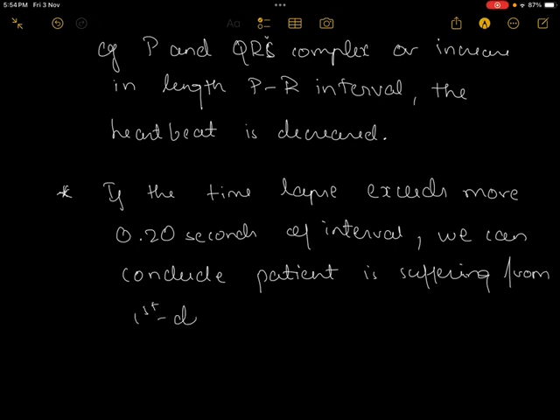First degree heart blockage. So this is a kind of diagnostic reason. Usually in terms of ECG, this is the key point which has to be remembered if we have to classify first degree heart blockage.